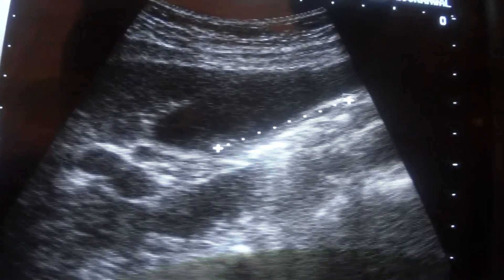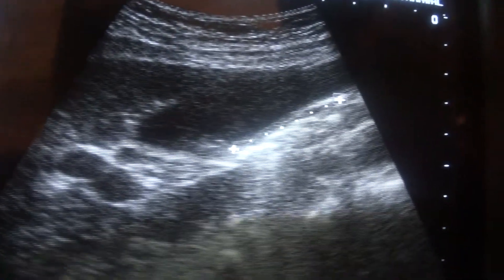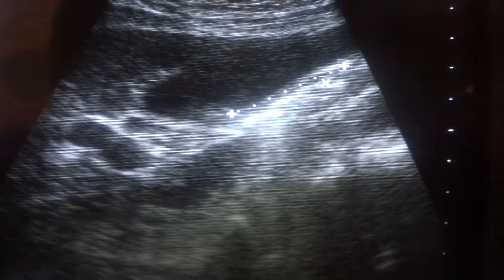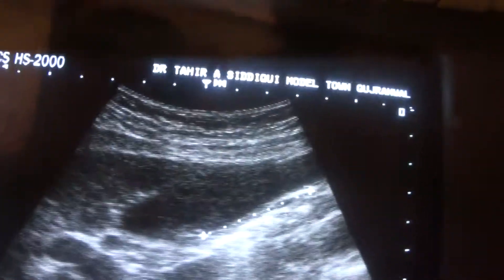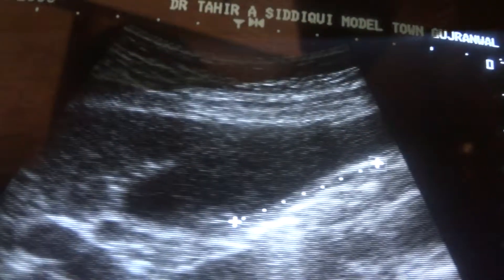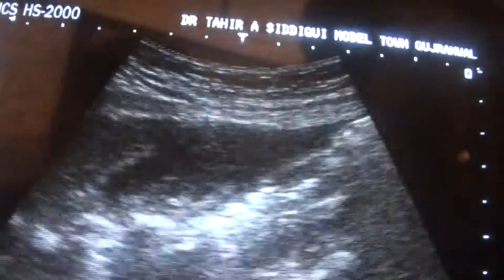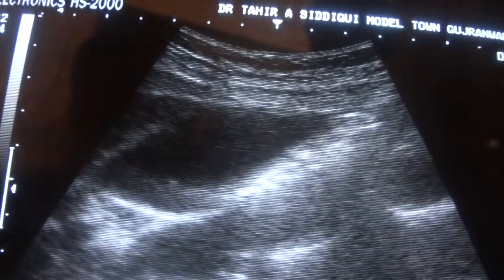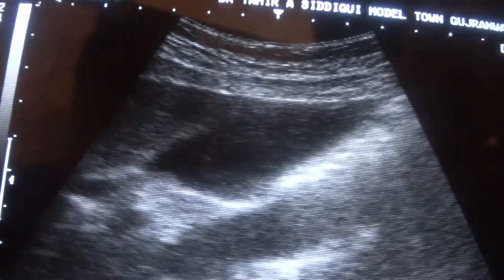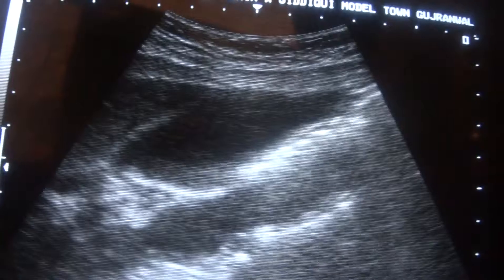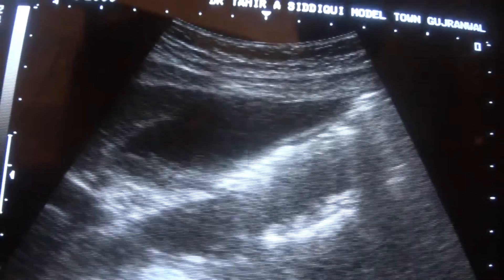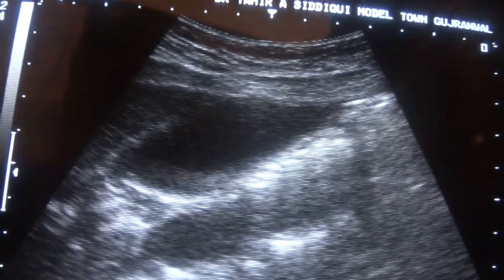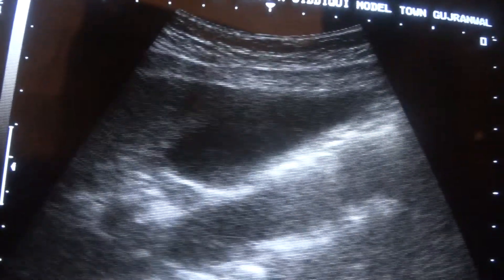The most important thing is that the posterior wall is inseparable, and these areas are posterior to the posterior wall of the gallbladder. So these are bubbles and these are not gallbladder calculi. If someone does not take care of this — this was cautious point number one.